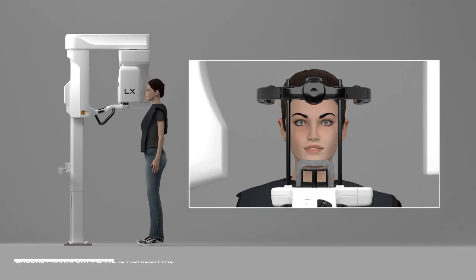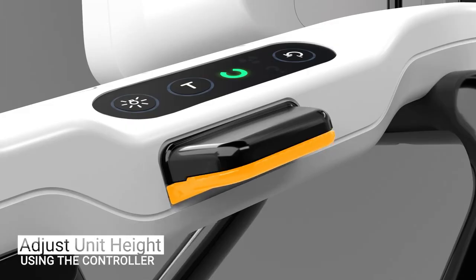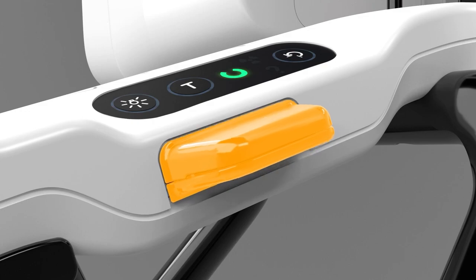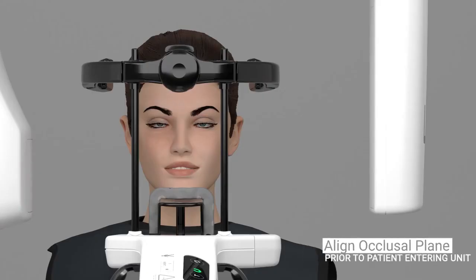To slowly raise or lower the unit height, press up from the underside of the controller or down from the top of the controller. For faster movement, pinch both sides of the controller while pressing up or down. Prior to the patient entering the unit, tell the patient to close their eyes.